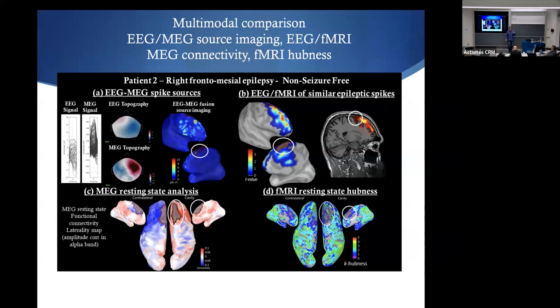And a hubness of 4 means that we have interaction between 4 networks. It would have been interesting to look at what are those 4 networks. We did not do that yet, but this is in the cavity, we have this intersection. So again, we are dealing with a cavity that is showing extended long-distance connectivity, and removing that was not beneficial for the patient, who is not seizure-free. So now we are analyzing that on more patients. These are just 2, and I'm going to stop there.